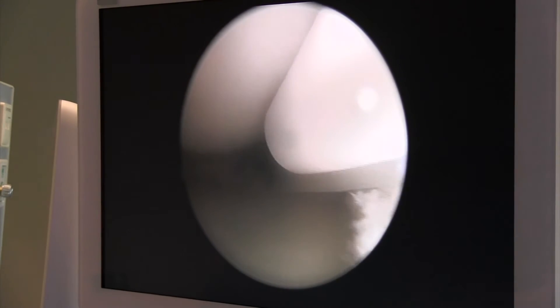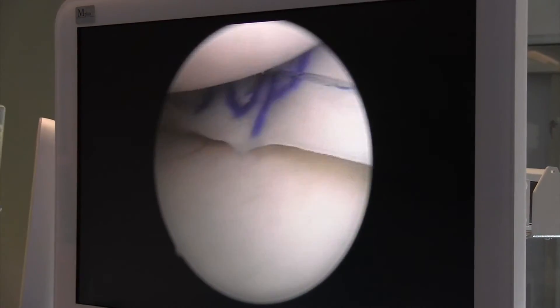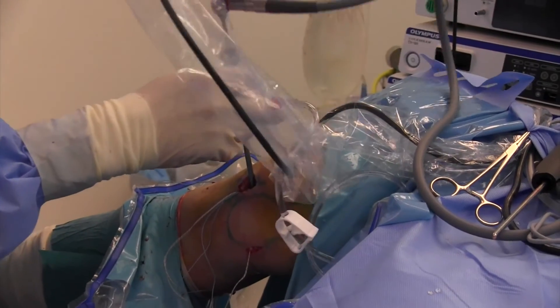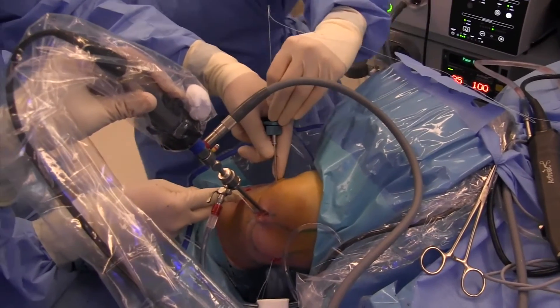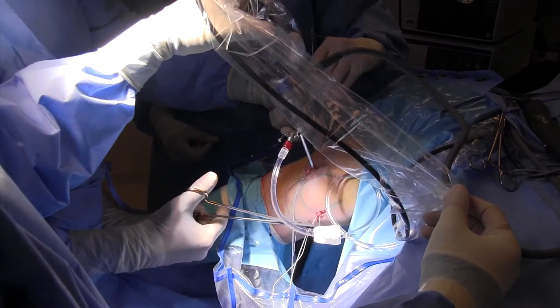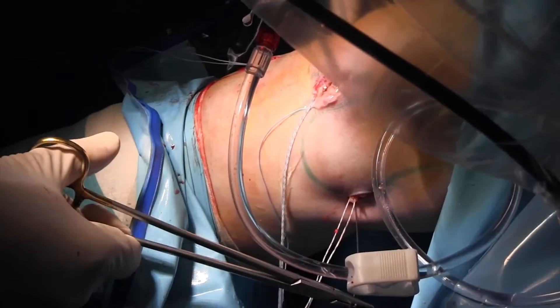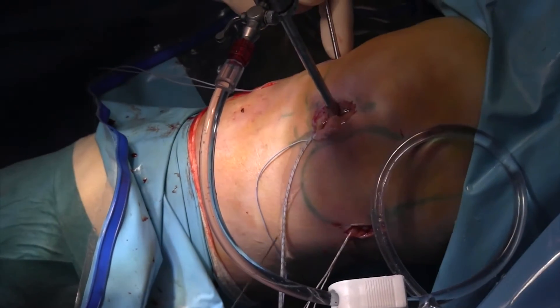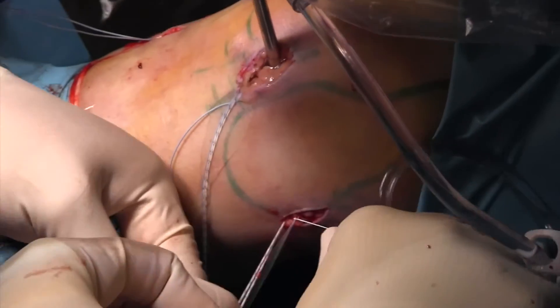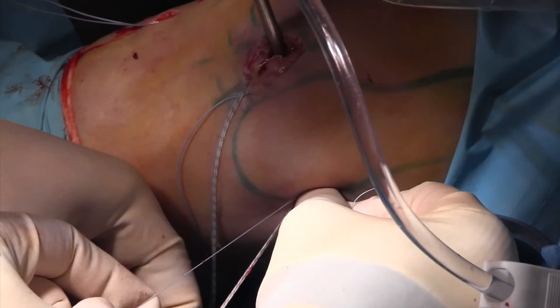I'm pulling on the knot. Here you can see the meniscus in place. Two or three sutures are placed on the side. Then I change portals and put inside-out sutures into the meniscus, and they are taken out of the posteromedial aspect. The same technique I use for the lateral meniscus. Then I tie the suture under visualization during arthroscopy, making it not too tight so that it doesn't flip upwards.